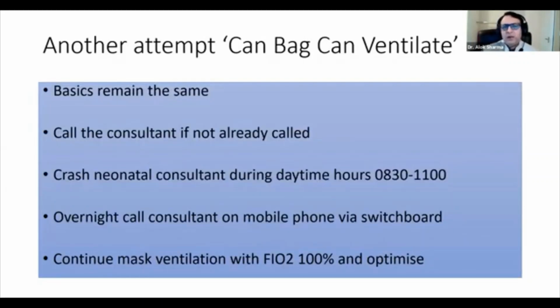Now, one of the questions that we commonly ask people, and I've asked that in a poll that I've sent out to you prior to this presentation, is how many attempts at intubation you would have if you were having difficulties ventilating. What I would say is that the basics remain exactly the same, but I'm very keen to know from you how many attempts you'd have in terms of intubation. So would you have 1, 2, 3, or 4 attempts before you called a senior for help? So let's see what the audience poll actually comes up with.